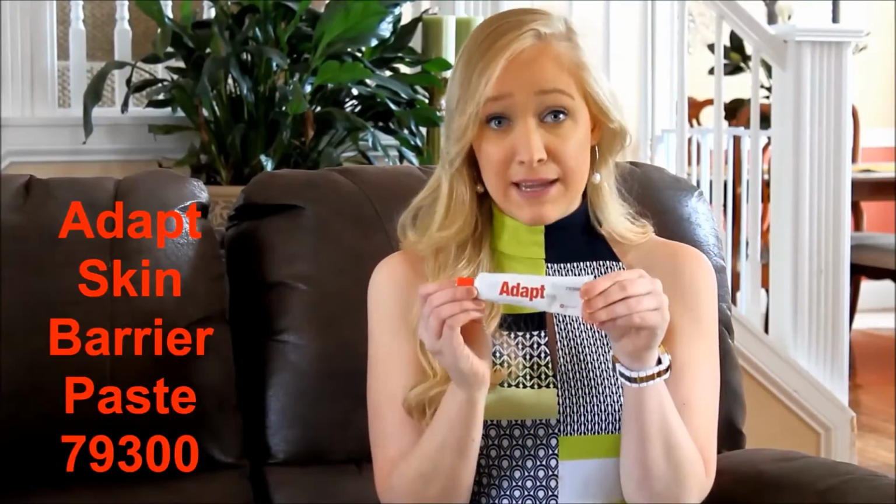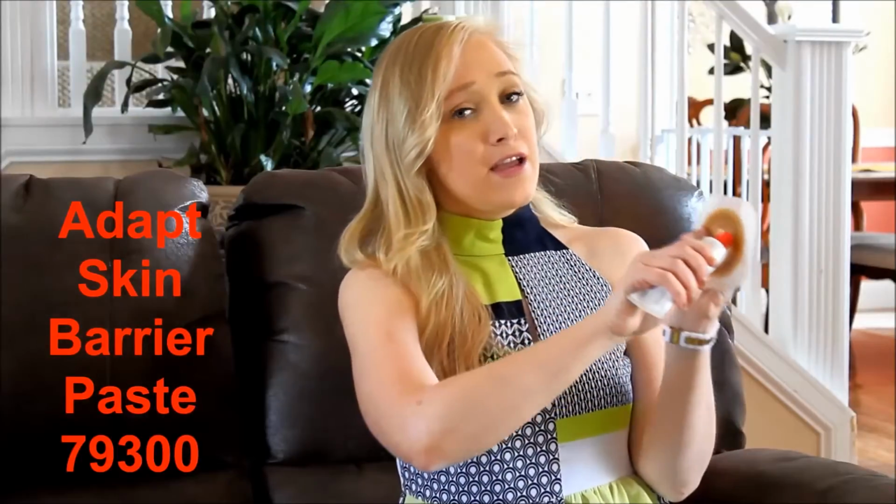So when I'm putting on my stuff, after I do the spray, I make sure the flange is pre-cut before I even start. So then I just peel the back off of my flange and I take this Adapt paste and I just line the circle of my flange on the back side, the sticky side. I line it with this Adapt paste. So some people use the wax rings. Those might work better for you. The Adapt paste works better for me because my skin, like I said, is uneven due to some scarring. And the Adapt paste really just molds to my skin better, and I think it just gives it a better seal and prevents me from having leaks.